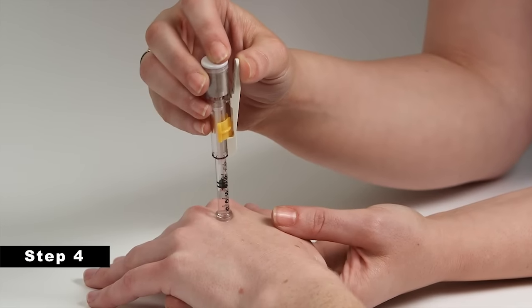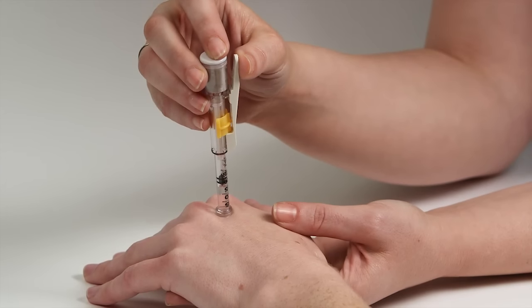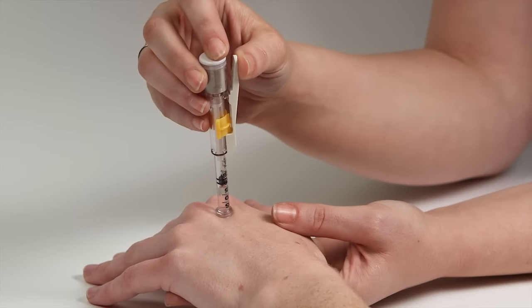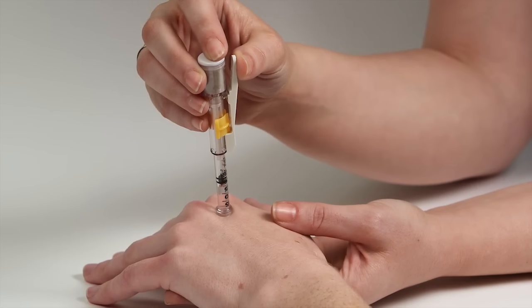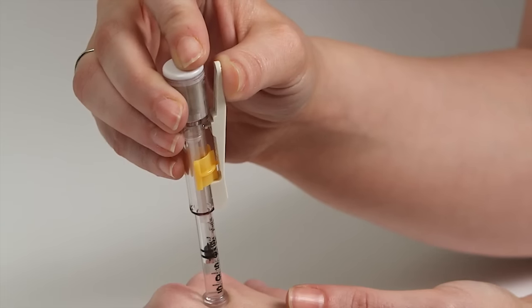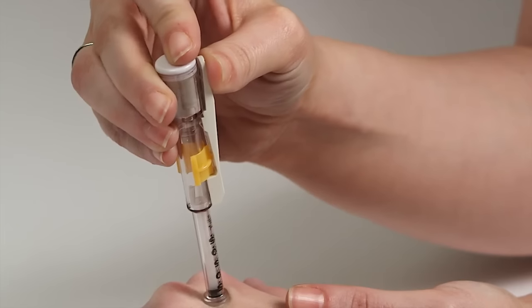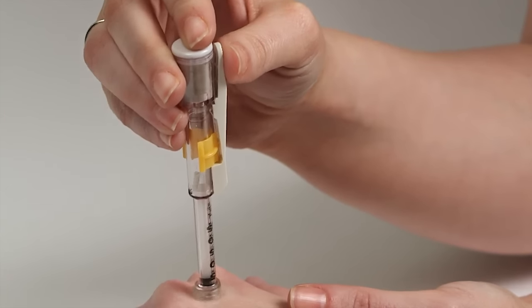Step 4. Inject the medication. Make sure to select the area that will have the most subcutaneous space. Next, hold the J-Tip at a 90 degree angle with light pressure against the skin. Keeping the J-Tip steady, depress the activation lever. Wait 2 to 3 seconds after the injection before removing the J-Tip and properly disposing it.